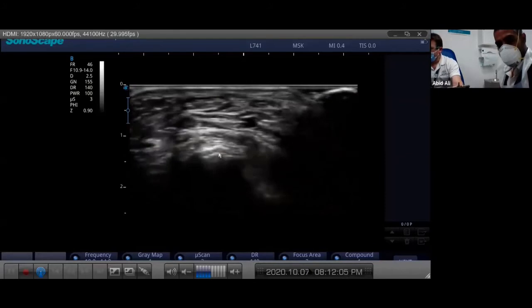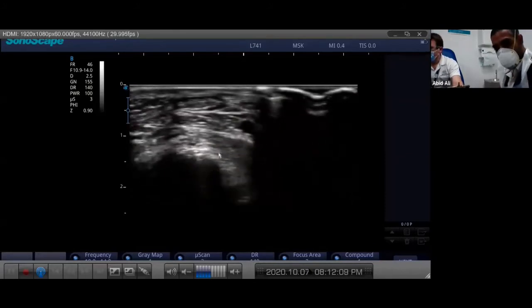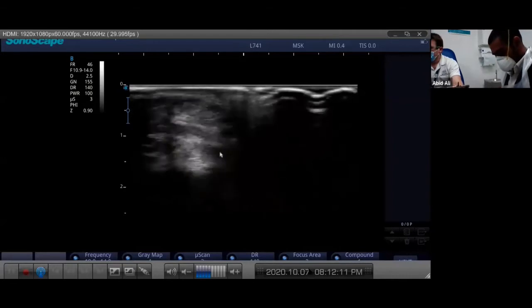You can take your probe away, sterilize everything, and do the injection exactly where you marked it. I use that technique quite a lot, but sometimes it's a real faff to do ultrasound guided injection and film it and report on it in a busy fast-paced clinic. Okay, let's move centrally - let's go medially.